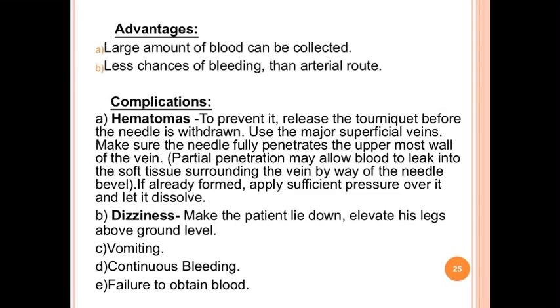The second complication is dizziness. Make the patient lie down and elevate his legs above ground level. Third is vomiting. Fourth, continuous bleeding can happen, and last is failure to obtain the blood.